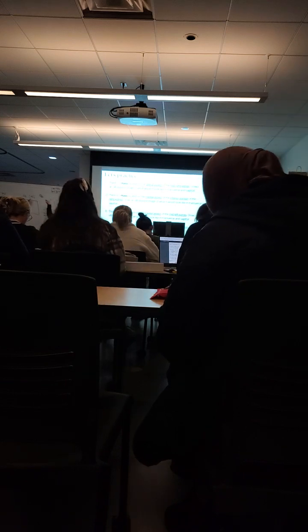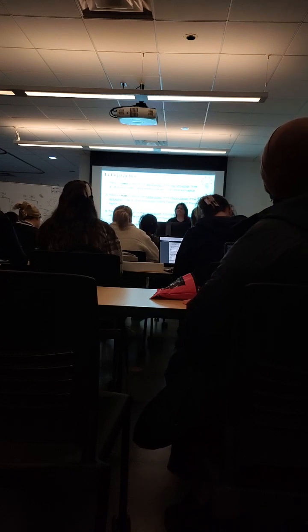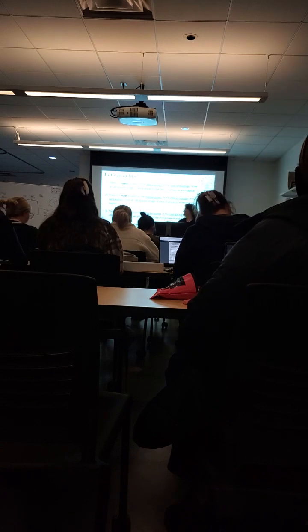So let's draw our, where are we at? Everybody help her out. In transverse, we're on the right kidney, so anterior, posterior, right lateral, right medial. And in sag, where are we? Anterior, posterior, superior, inferior. All right. Is that correct? Yes. She's drawing the C. Good. She's going to draw her other one.